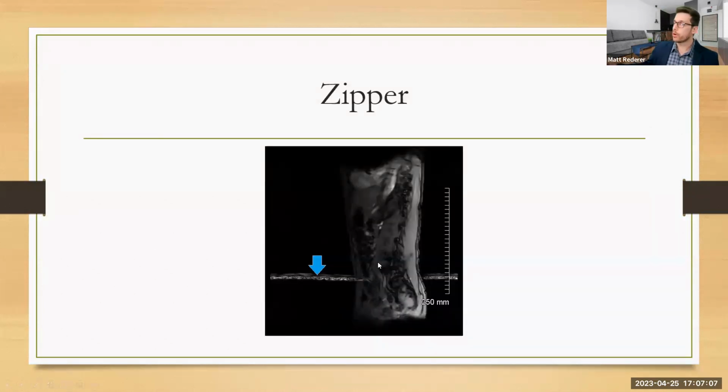All right, this is called the zipper artifact, and it's because it looks like a zipper across your screen. What it is essentially is contamination. So if you're in the room scanning, minding your own business, and let's say you left the door open or you installed new lights in the room and you didn't check to make sure there weren't LED lights, and all of a sudden you see this streak across your image. Let's say it goes away in the next sequence, and then you get a phone call and you see it again. Well, it's contamination, interference from RF.